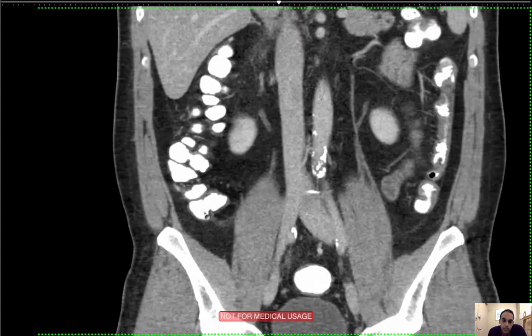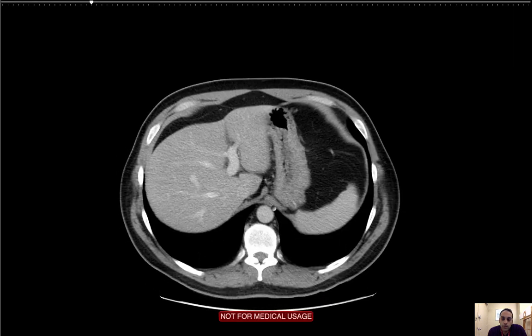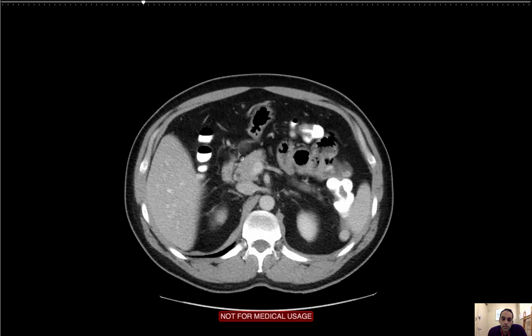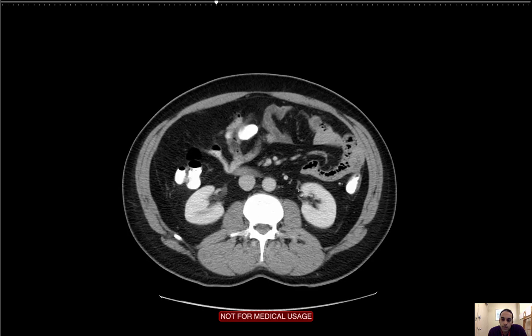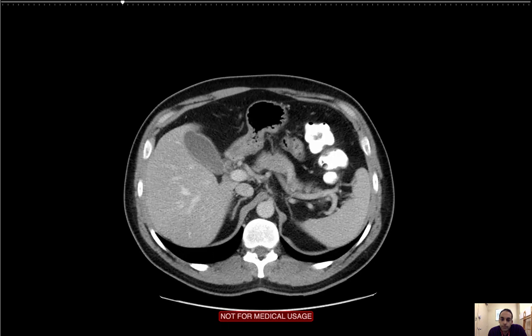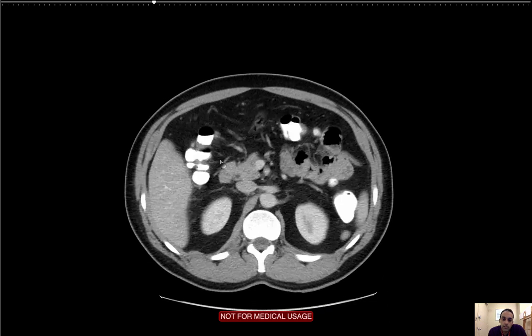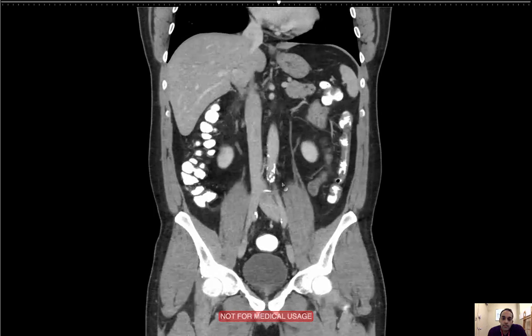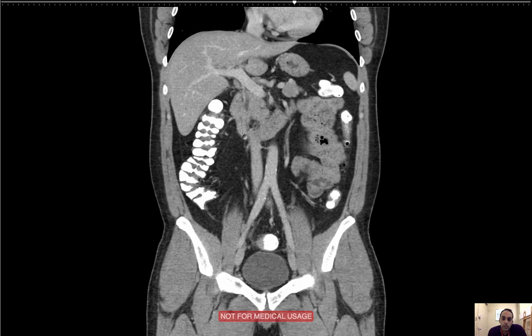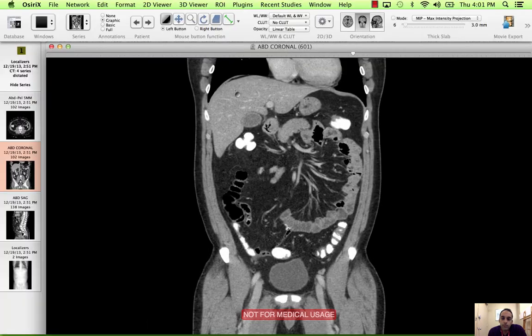I'm not seeing the appendix here — the patient may have had an appendectomy. Now that I've cleared the colon, I like to start with the stomach. I'm coming to the stomach — the gastroesophageal junction, the cardia, the fundus, the body, and the distal stomach. I've got the first portion of the duodenum, the second portion, the third portion coming across the retroperitoneum, and the fourth portion coming into the jejunum. They look normal — no thickening, no ulcer disease, no inflammation. There's no evidence of malrotation because the duodenal sweep is normal. On the coronal plane you can see the second, third, and fourth portions of the duodenum, and the duodenal bulb near the porta hepatis.